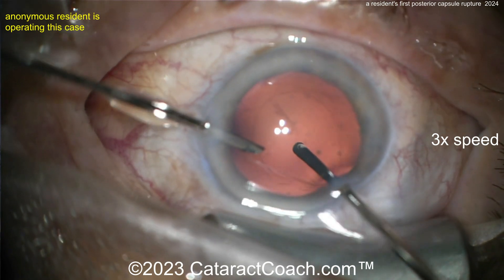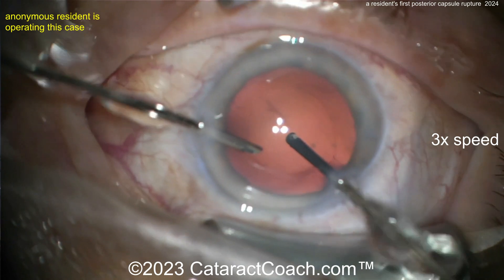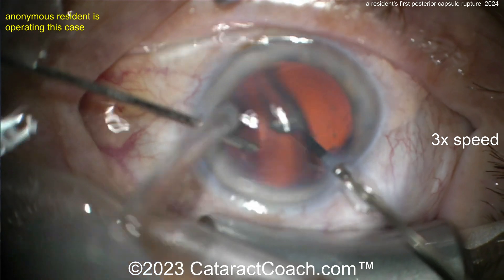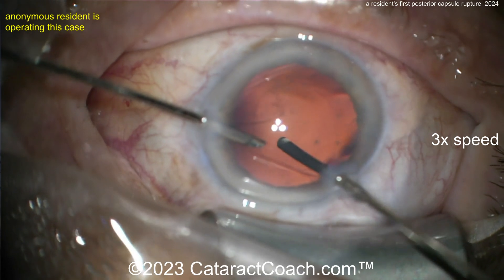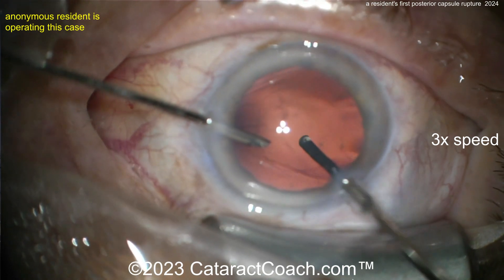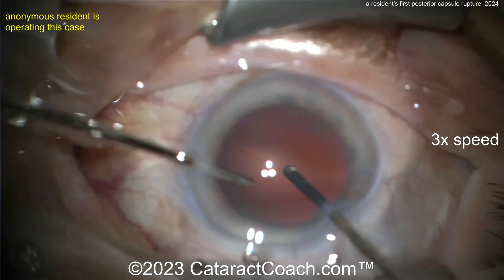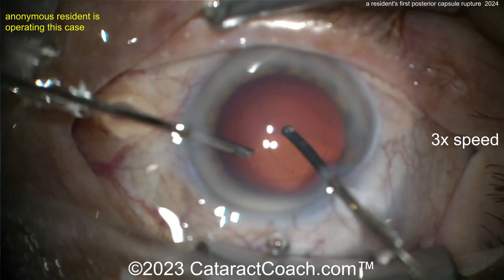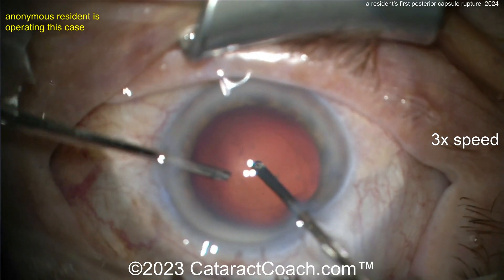Go back to anterior vitrectomy mode and really clean this up. Inject triamcinolone to visualize remaining vitreous prolapse. Also use miochol in the eye to bring down the pupil and confirm there's no vitreous causing a peaked pupil. Finally, after placing the lens, put a suture in and watch this patient very carefully in the post-operative period.